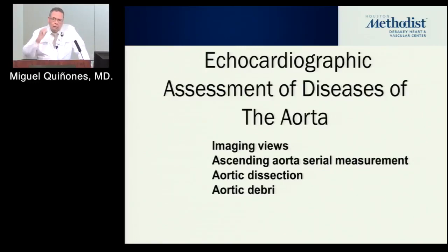So what I'd like to cover with you is imaging views, something about serial measurements, because we do that in the office, aortic dissection, and one entity that echo is actually very good with, which is aortic debris or atheromas, which with TEE, we actually do get a beautiful view of.